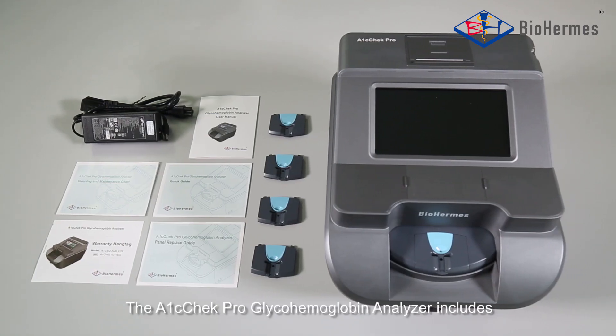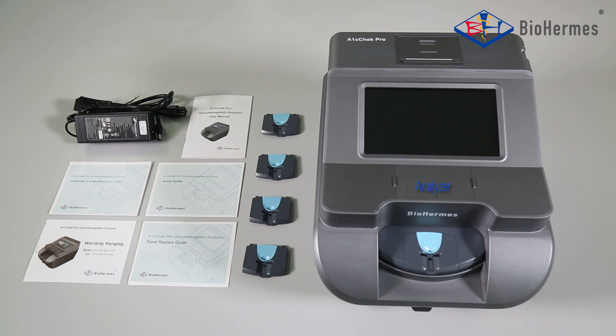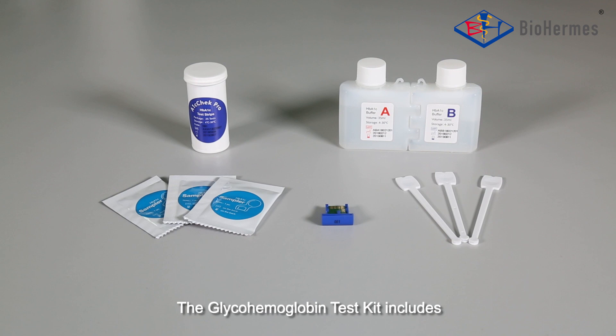The A1C Check Pro Glyco-Hemoglobin Analyzer includes: the Analyzer, Power Adapter, Spare Panels, User Manual, Quick Guide, Cleaning and Maintenance Guide, Warranty Hand Tag, and Panel Replace Guide.